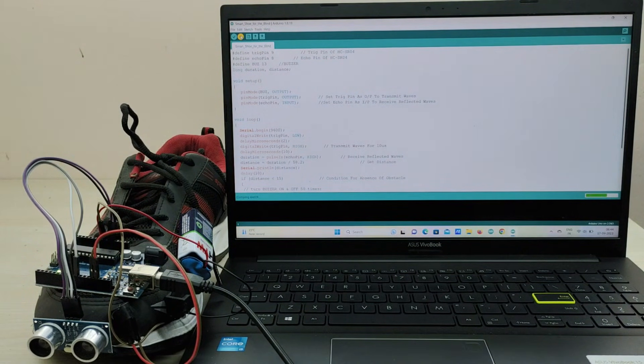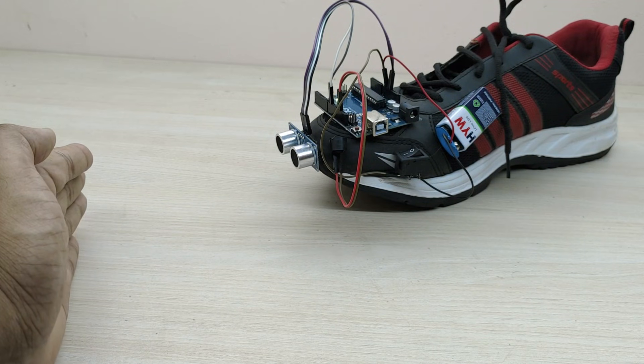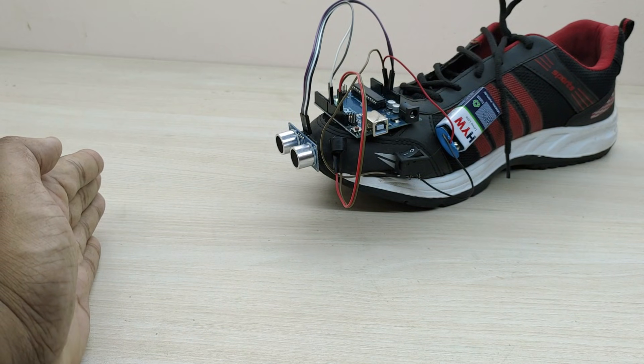Let us now test the working of the smart shoe. When we bring the hand near the sensor, the buzzer alarm goes on, thus alerting that there is an obstacle in front of the shoe. Also, when the hand is moved away, the alarm stops.